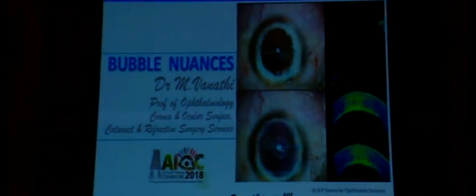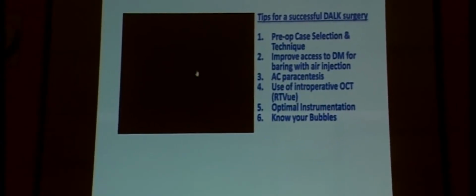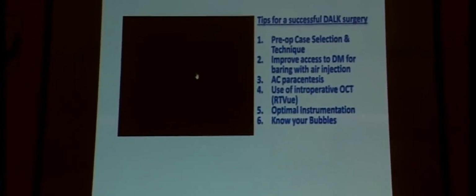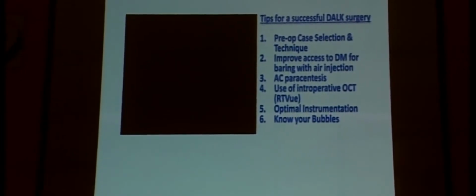So much of manual DALK, and much of what is important, has already been covered by Rishi. So when you look at big bubble DALK, the secret lies in how you would probably achieve your big bubble without converting most of the time. So let's move on in the interest of time to knowing what type of bubble you need to achieve. What is the type 1 and what is the type 2?